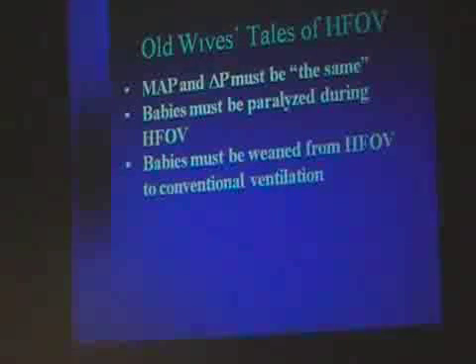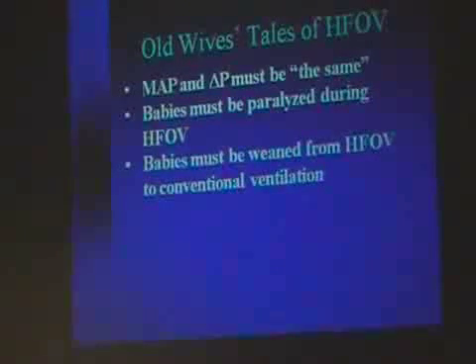If the baby is breathing, it's fine, but if he's really working, the likelihood is that you don't have enough support. Either your mean airway pressure is insufficient or your delta P is insufficient, because he obviously shouldn't be fighting you and breathing really hard, because that means he's working and he's not getting enough support.